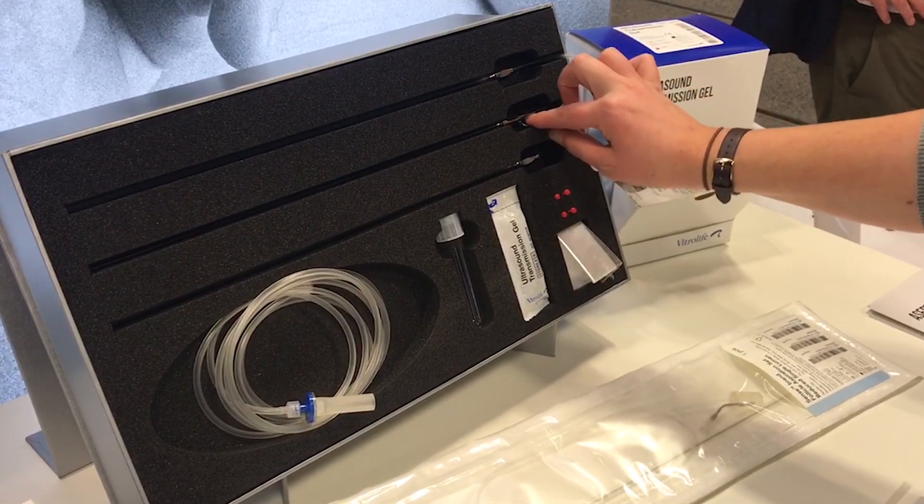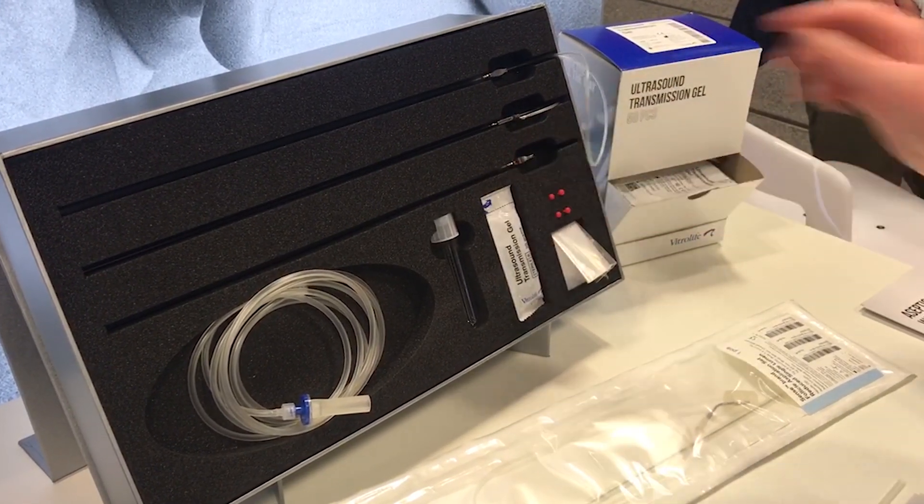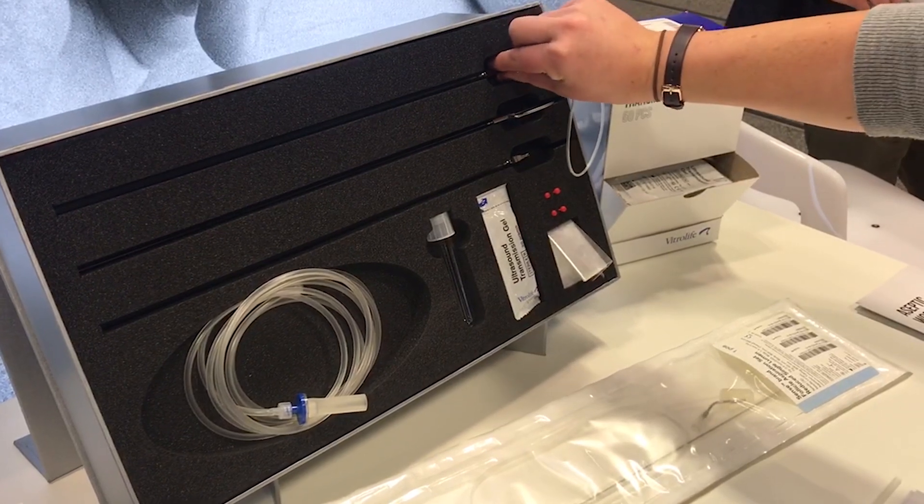So we have a double lumen needle, a single lumen needle. These all come in varying lengths and sizes, but the one that we want to focus on is the Sens needle.